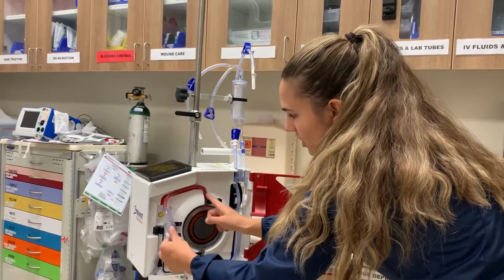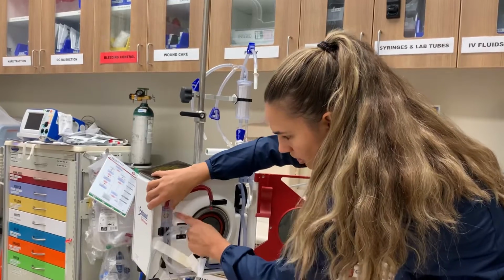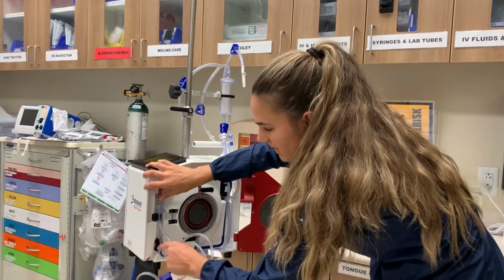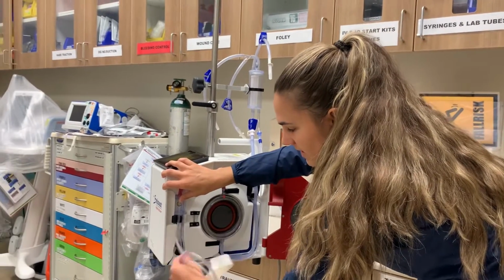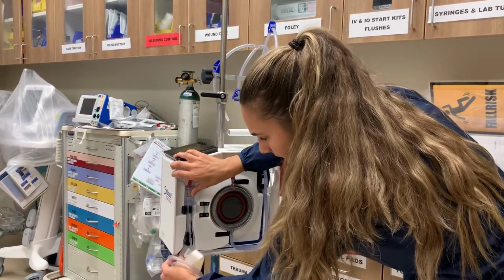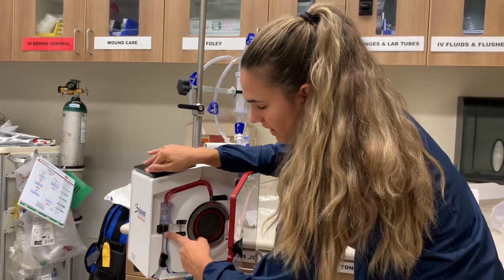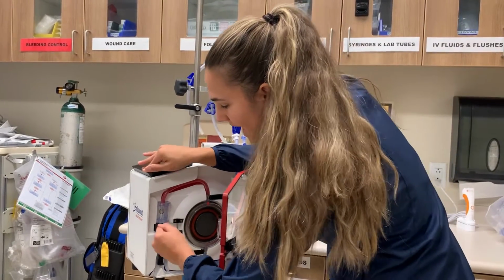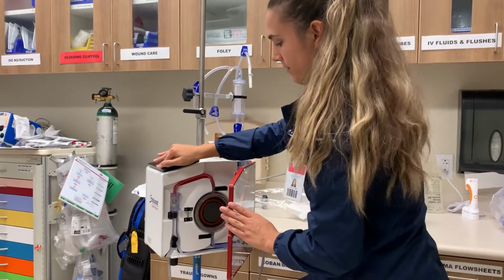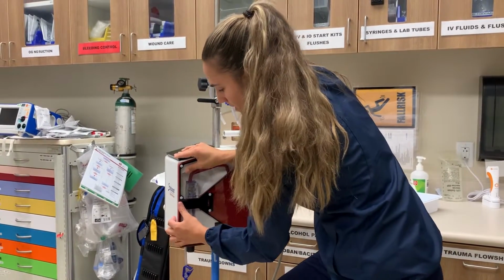Once you have that matched up, the red is going to follow the red line through. This little chamber is going to go right in there. Now you're going to see the 2 blue lines again, so this part of the tubing on the left is going to go on the left side, and this part of the tubing on the right is going to go on the right side. If you slide the tubing into this black nook right there, that'll hold the chamber in place. Now you can close the door once everything is matched up.